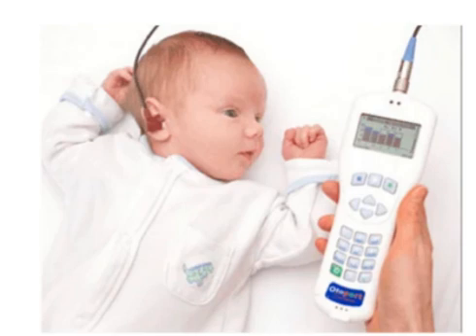The abnormal OAE in tinnitus suggests that cochlear and outer hair cell dysfunction may play a role in its generation, particularly at higher frequencies from 6 to 8 kHz. The connection between OAE and tinnitus may also play a role in monitoring progress during tinnitus retraining therapy. However, more research is necessary on this topic.